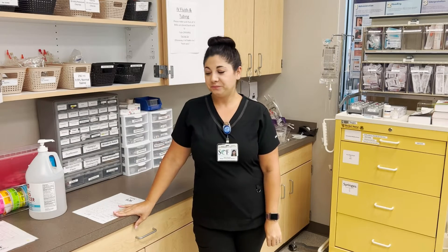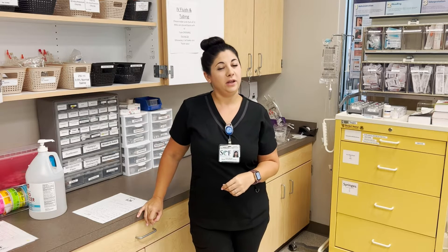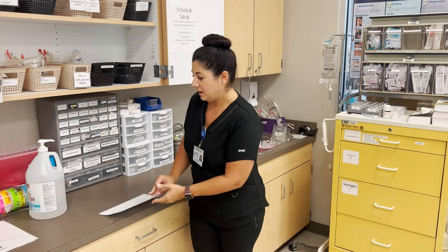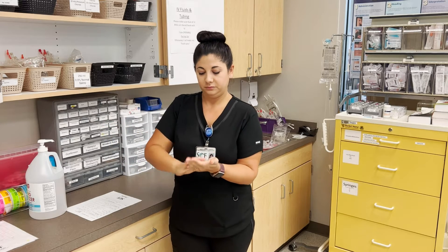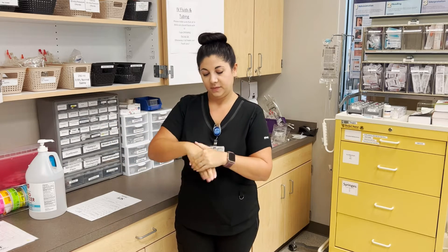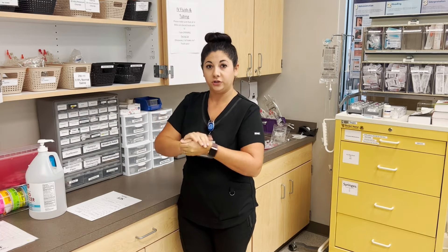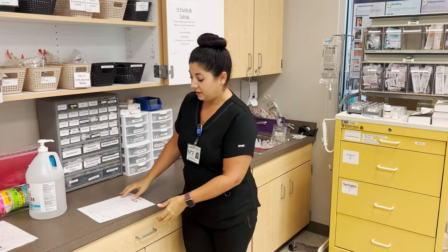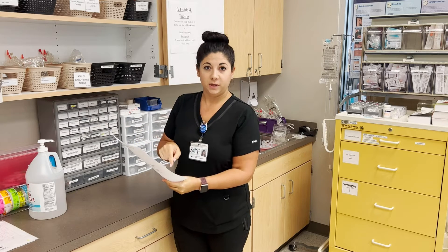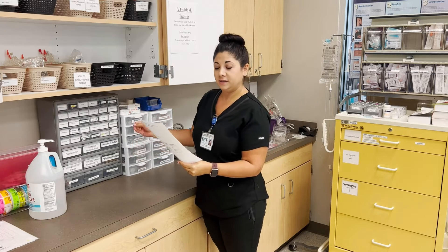We are going to be giving meds now. I have already assessed my patient, taken vital signs, and assessed the need for any PRN medications. I am coming to the med room. I'm going to wash my hands and then look at my MAR, making sure I have the correct patient — their name and date of birth are correct. I'm looking at their allergies to ensure I'm not giving anything they might be allergic to, and looking at the time to determine which medications I need to give. Then I will pull the medications from our automated dispenser.